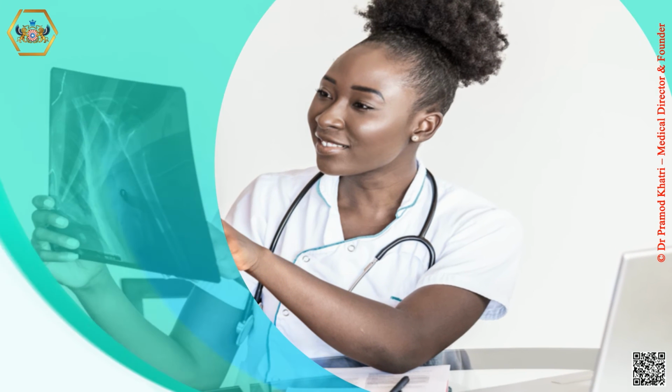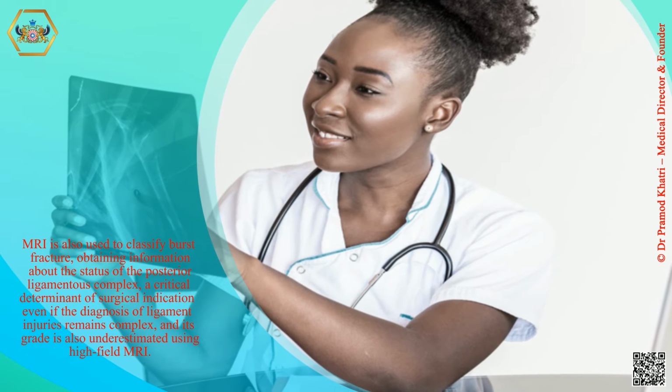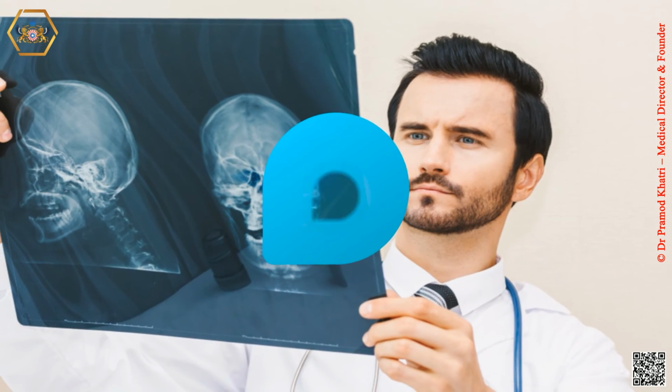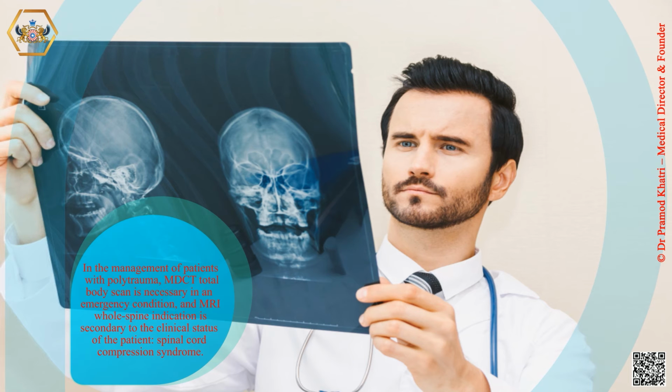MRI is also used to classify burst fracture, obtaining information about the status of the posterior ligamentous complex, a critical determinant of surgical indication, even if the diagnosis of ligament injuries remains complex and its grade is also underestimated, using high-field MRI. In the management of patients with polytrauma, MDCT total body scan is necessary in an emergency condition, and MRI whole spine indication is secondary to the clinical status of the patient, spinal cord compression syndrome.